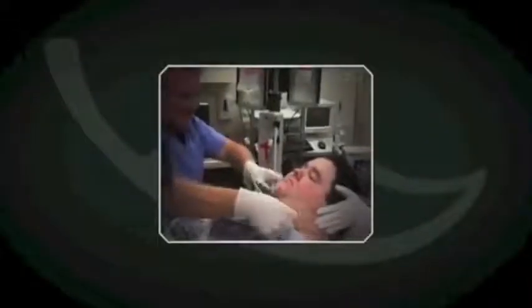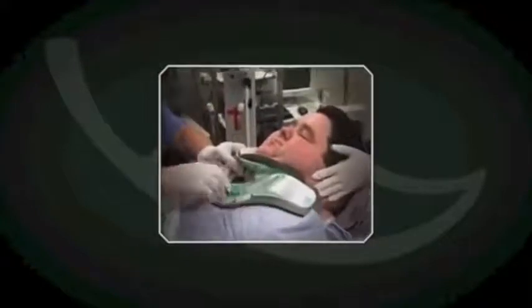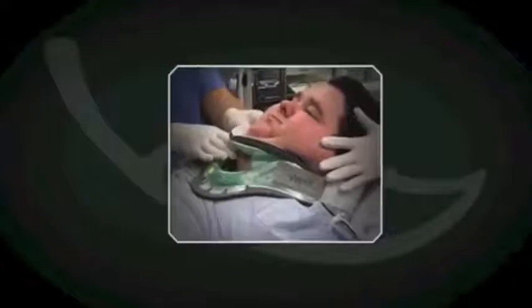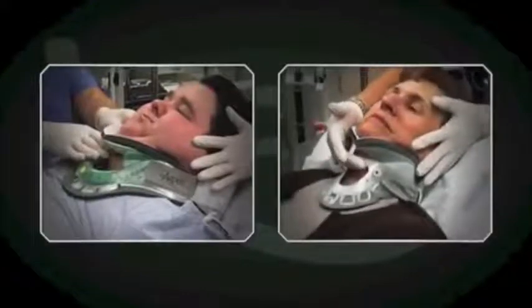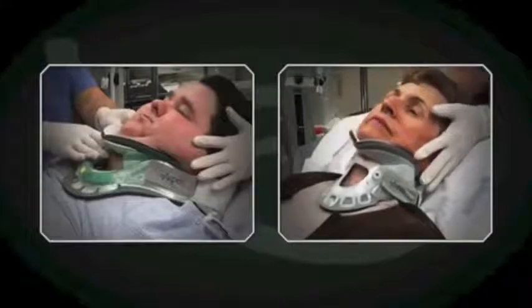For very large or heavy patients, a Vista large back is available. For extremely large patients, use the extra large back panel to ensure that there is plastic to plastic overlap. For extremely small patients, such as children or the elderly, consider the use of the Aspen PD-5 collar.